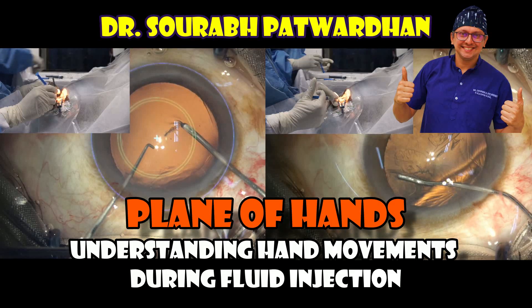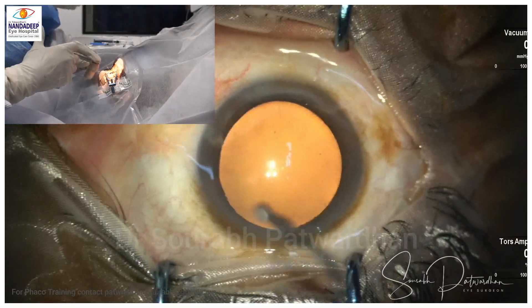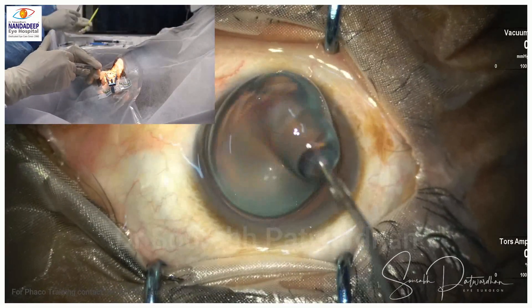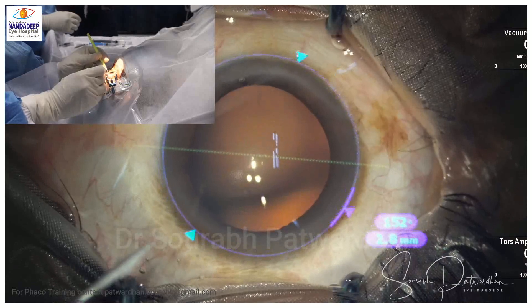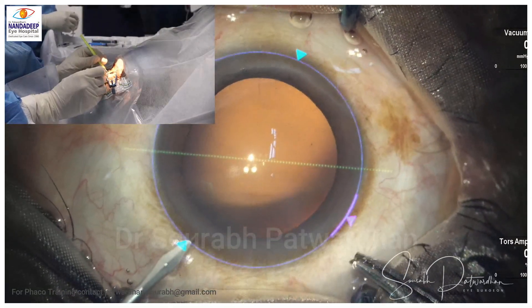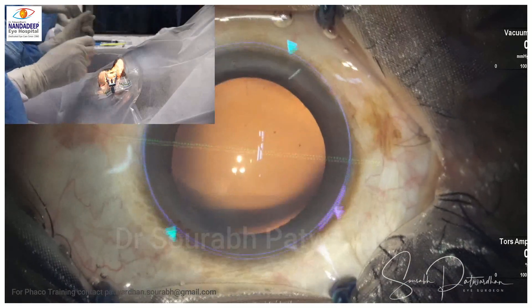Let's do some spying on the hand movements of this surgery. It's very important during phacoemulsification, or for that matter any surgery, that we study how the hands are moving. When we are doing microsurgery under the microscope, many times our hand movements are in our blind spot — we are not exactly sure how our hands are placed around the patient's eye.